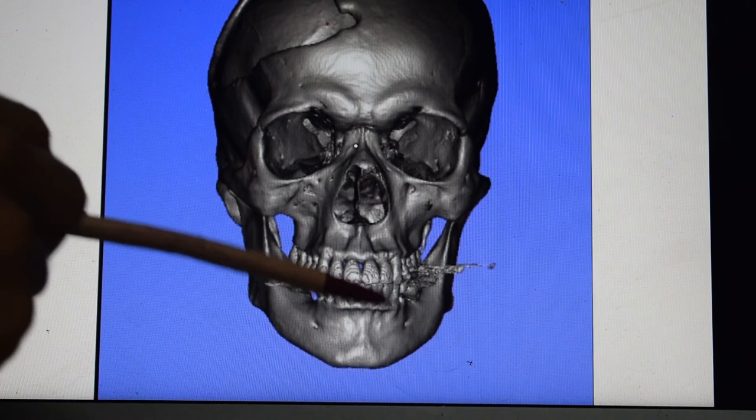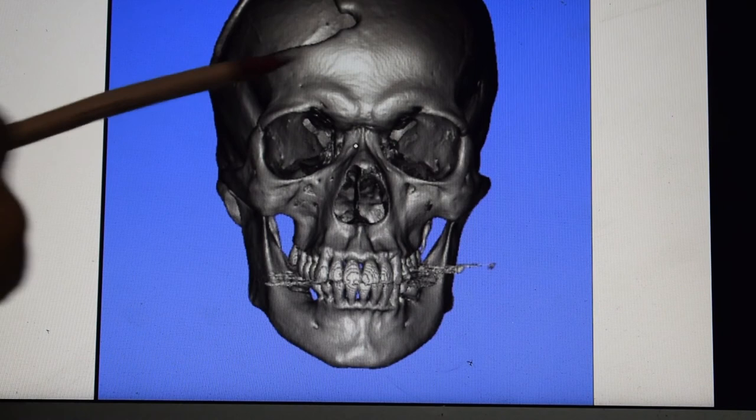Here you can see the mandible, and in this 3D CT you can see that there is a fracture in the skull bone — a depressed fracture of the skull bone that we have to treat in this case.